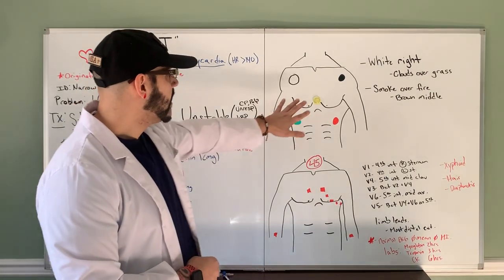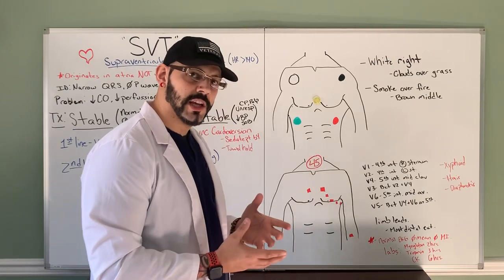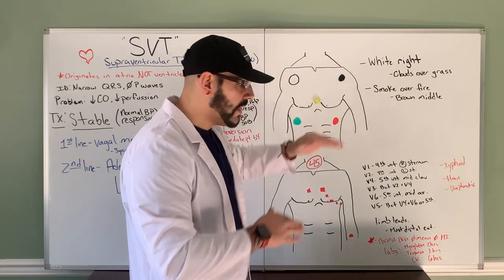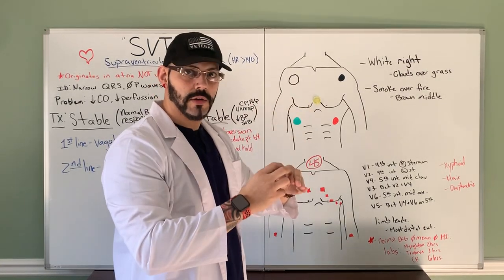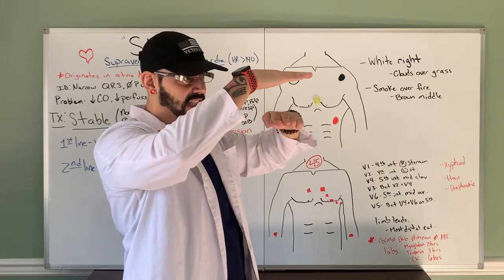So as I was saying, they may grab a towel or some type of thick cushioning to place on top of the patient's chest, on top of the padding, to push down. That way you close the tissue area, so the shock gets delivered even better. Okay, because you have all that fat or muscle, they may want to put their hand there to press down the padding.